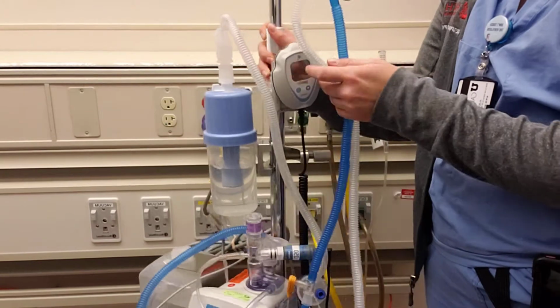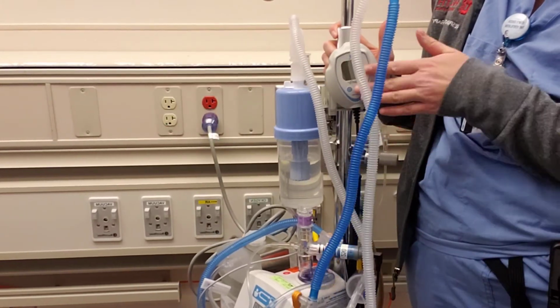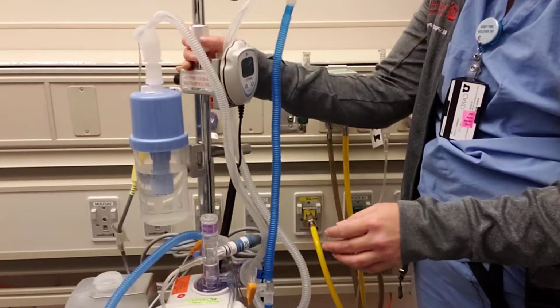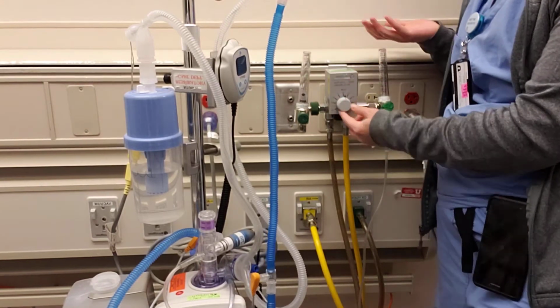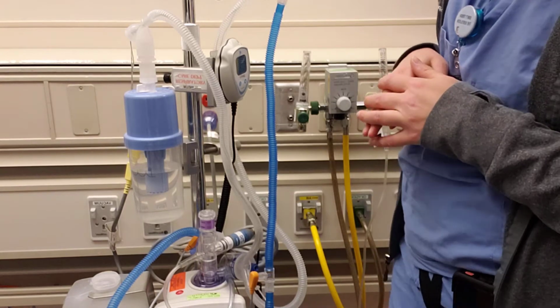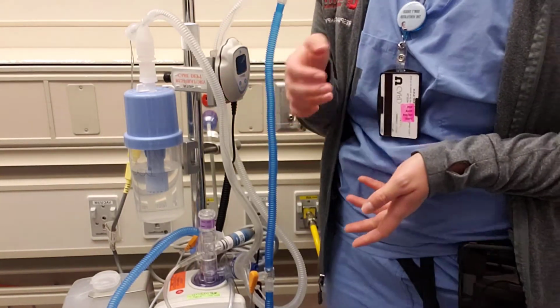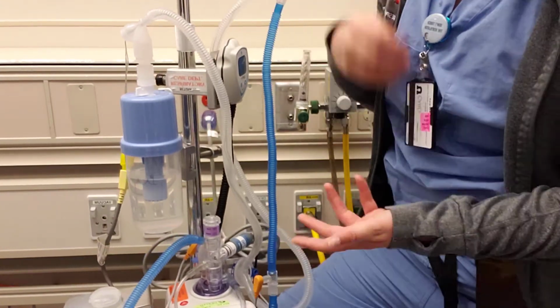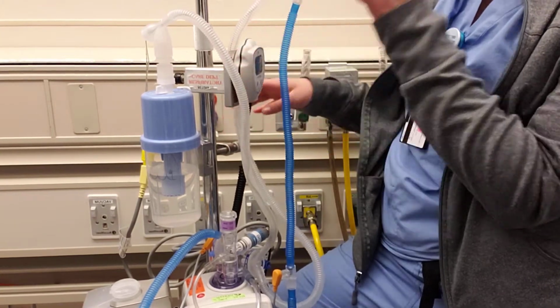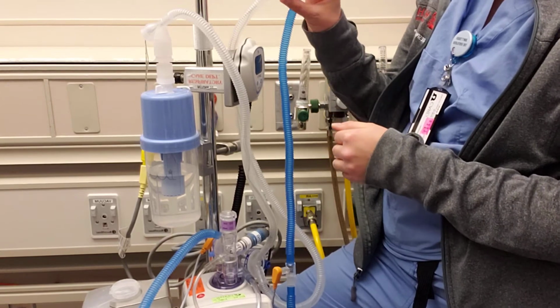And then I like to attach an oxygen analyzer, the one that was with our original T-piece. That way I know exactly what FiO2 I am administering. And with the blender over here, you can adjust whatever FiO2 is needed for your baby. This is a good piece of equipment. It sets up fast, takes down fast. It's pretty inexpensive for respiratory equipment, because no respiratory equipment is cheap. But it does great work, and I've seen it help out a lot of kids.